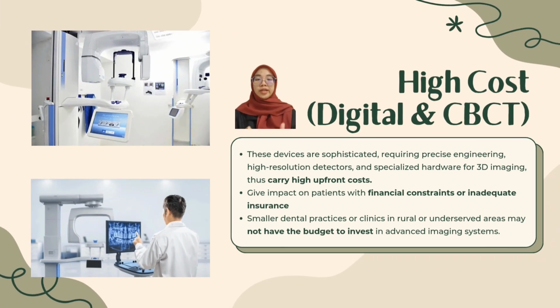Finally, the high cost of advanced imaging technologies such as digital systems and CBCT poses a significant barrier. These devices require sophisticated engineering and also high-resolution detectors, which make them expensive to acquire and maintain. This can be a burden for patients with financial constraints or inadequate insurance coverage. Additionally, smaller dental practices, especially those in rural or underserved areas, may not have the resources to invest in such systems, limiting access to advanced imaging capabilities like CBCT or other digital modalities.